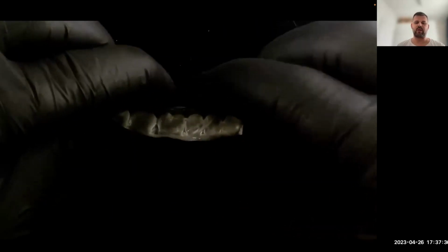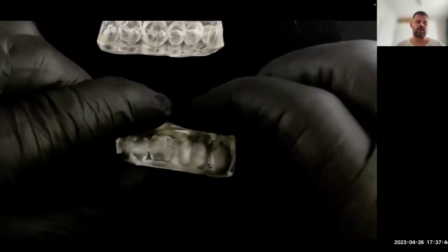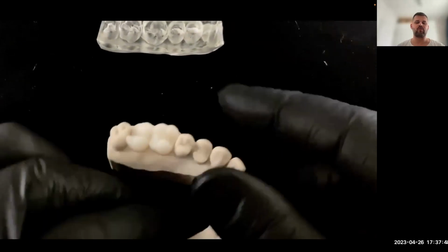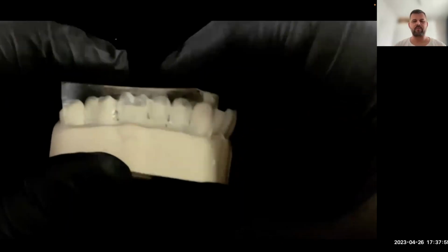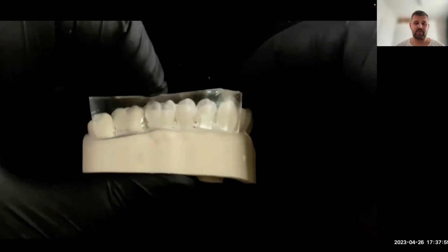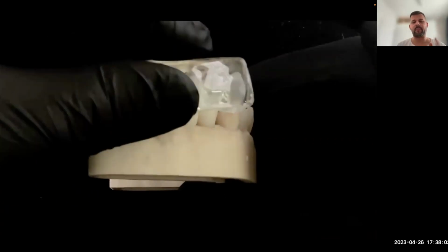Because with this flexible silicone index, you can change the dimension. When you have this stiff one, you cannot change anything. And when you want to restore the posterior area, and sometimes it's difficult to get a proper fit, you will try to use some force. And when you use force, you can change the shape of the tooth, and also change the contact with the upper arch.